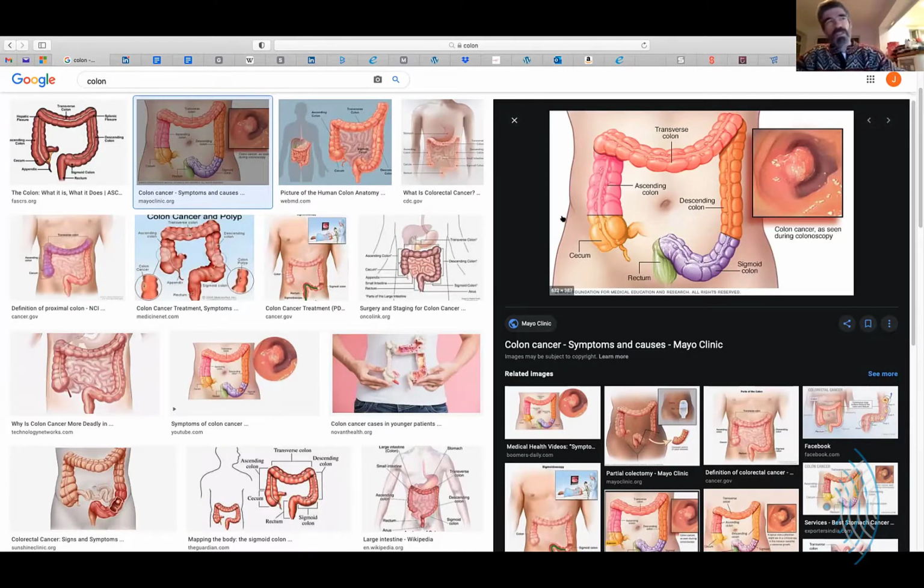All right. And this is a big tube, and you generally see it full of air. So that wide caliber thing with lots of air noise, where you only see a very fine bit of bowel and then lots and lots of rubbish picture underneath, which is air artifact, is typically the colon coming round here.